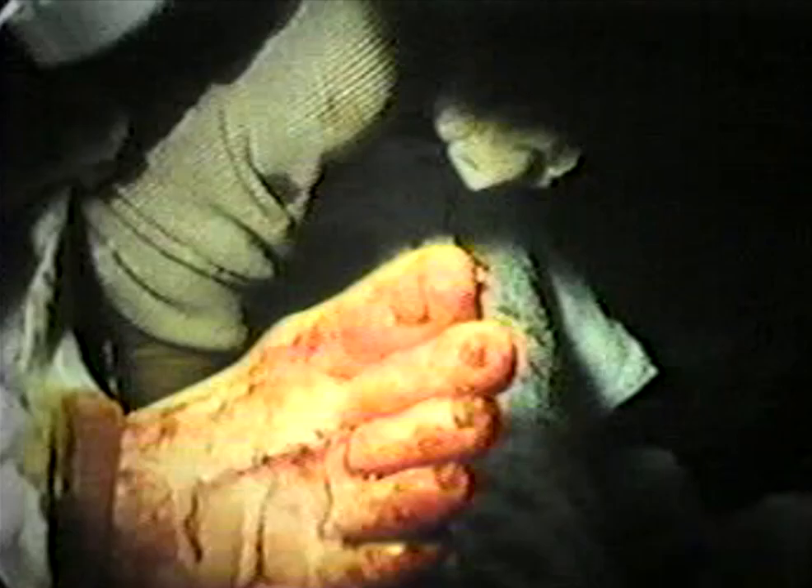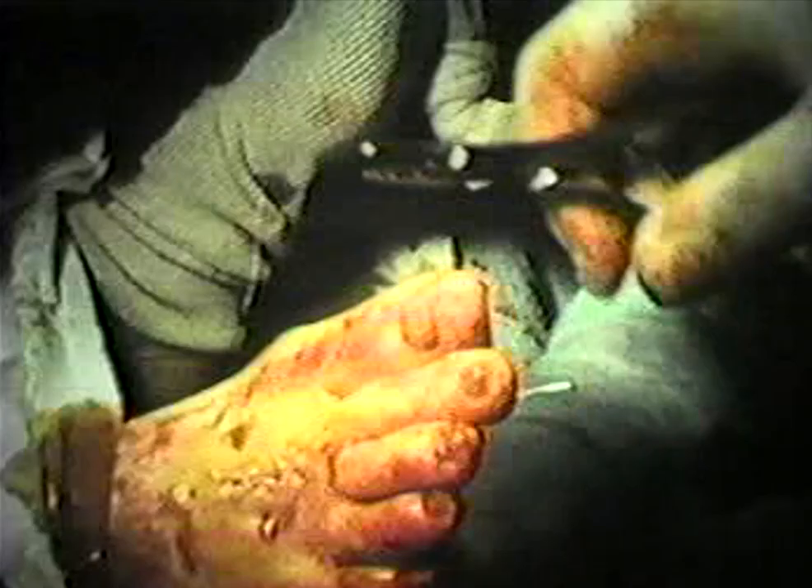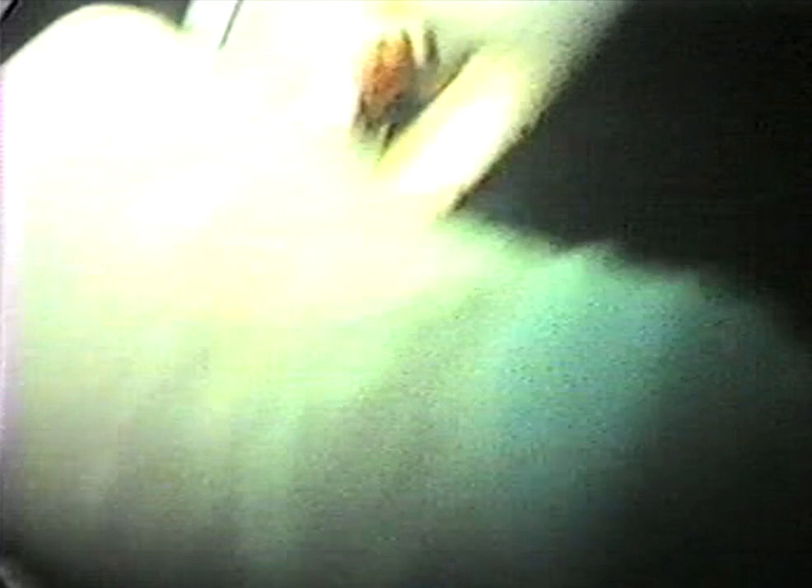There is always a space left in the web to allow for drainage so that we do not get hematoma formation. This space closes itself in approximately two weeks. Two simple sutures are used across the incision line to lock the subcuticular suture in place. The area is compressed to remove any excess blood through the opening in the web space.